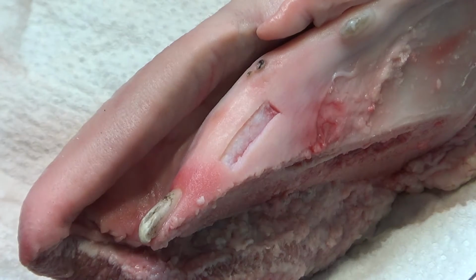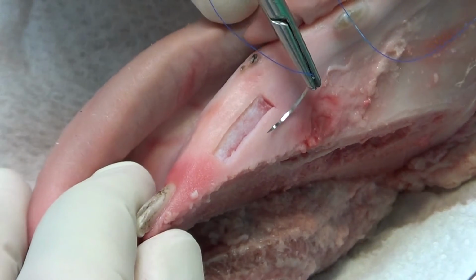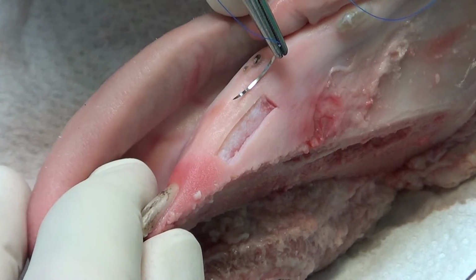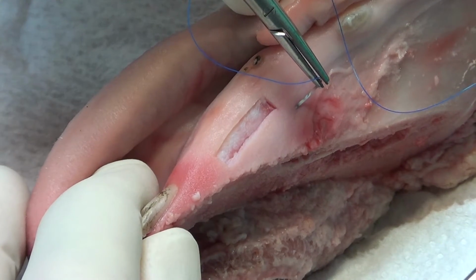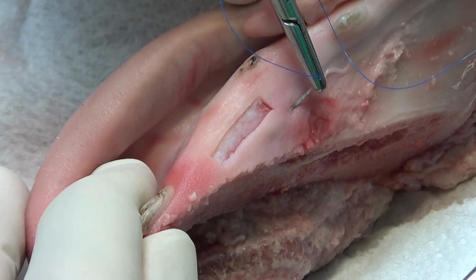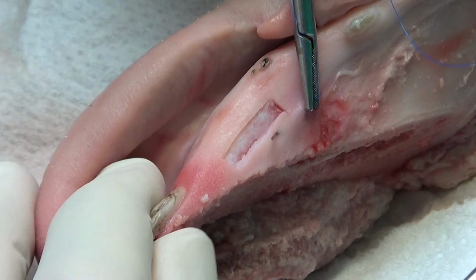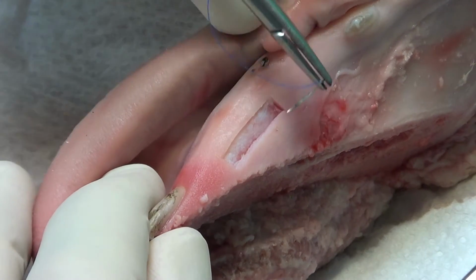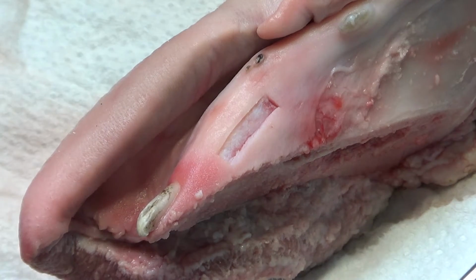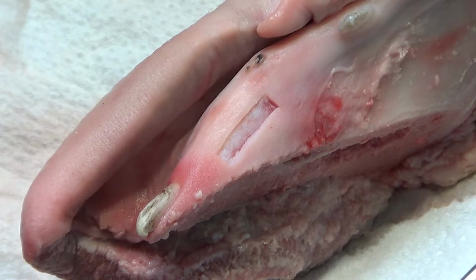So now to fix the sponge, you can do like this. Imagine to be apical here and coronal here. So start in the distal apical area, you do like this, you re-exit in the same part. You can start also a little bit closer to the beginning. We can do everything because I have the best assistance of Estonia today.